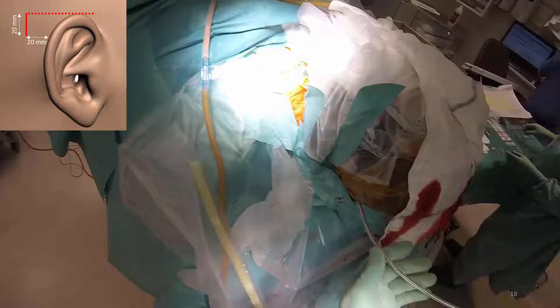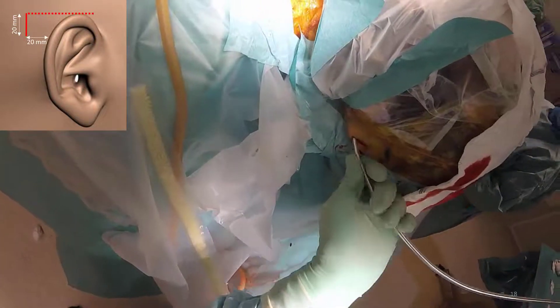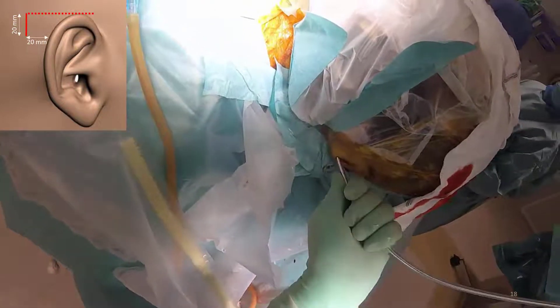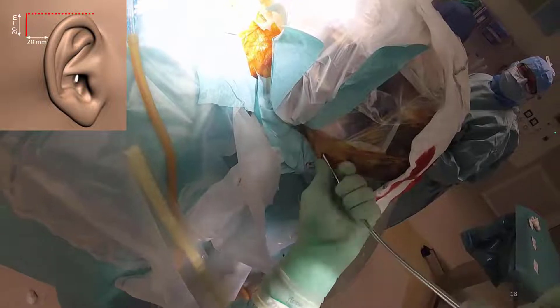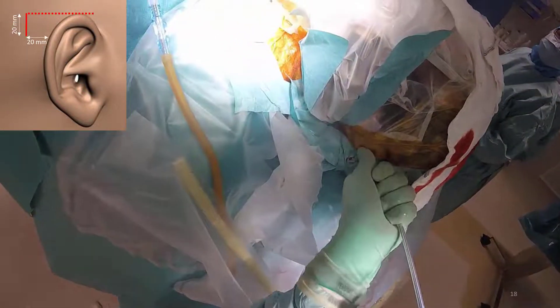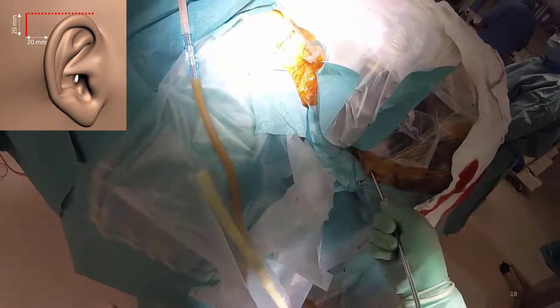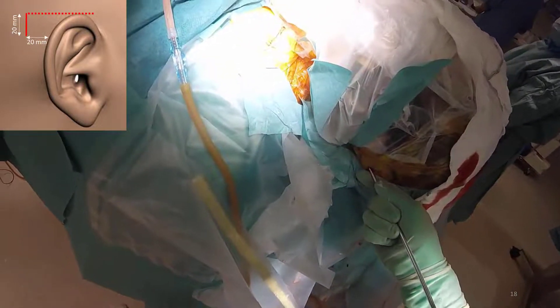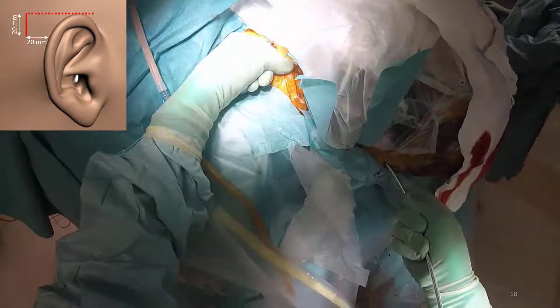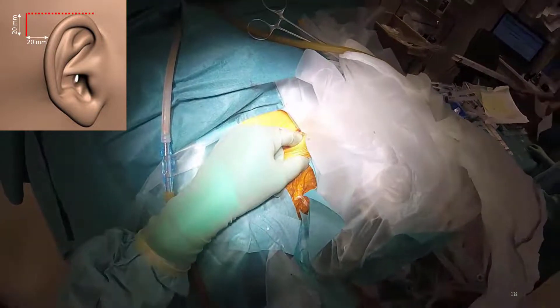To make the electrode implantation awake, and then to remove the dressing and the frame, and then to sedate the patient before dressing the patient again for the implantation of the IPG and connection cable, will take a very long time. If the procedure is done with the patient asleep, we can just continue with implantation of the IPG and connection cable immediately after the electrode is in place, without the need for new dressings or removal of the frame.